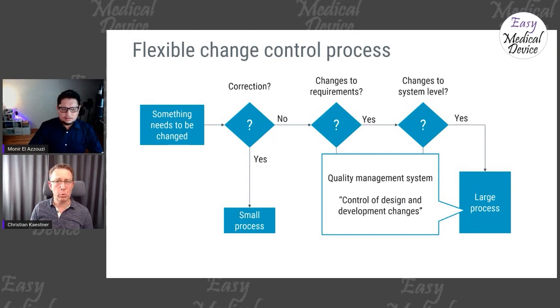And I think it's a very important point, because some are luckily staying with MDD for a few more years. Exactly, until 2024. So they still have the chance to stay with that. So use this chance, but be careful with the bigger changes. Especially if you're a Class 1 device, because if you make a bigger change and you have a software-only device, it's a big risk that you will end up in Class 2. Exactly. So notified body, then update of technical file, update of everything. So yeah, it can be a nightmare for you.